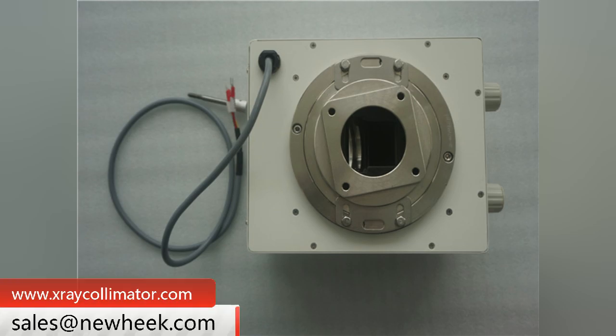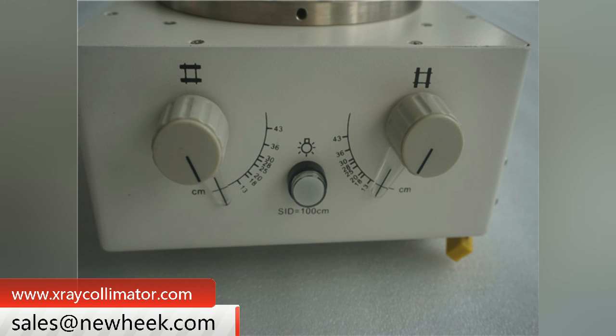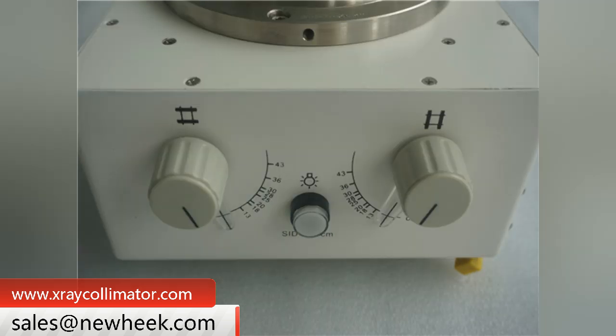The shell of Nuheek X-ray collimator products is made of iron. The X-ray beam limiter with multi-function square field of view is used to make the beam limiter have a stable system.